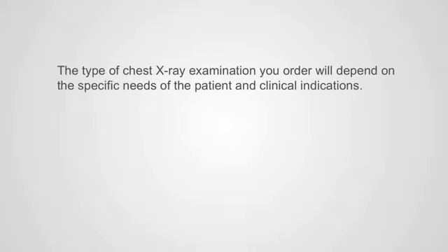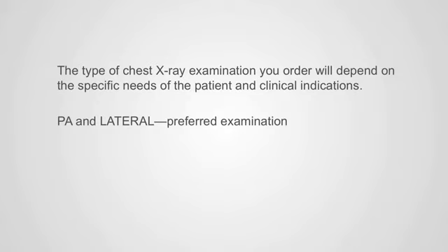So to recap, the type of chest X-ray examination you order will depend on the specific needs of the patient and the clinical indications. The PA lateral X-ray is the preferred examination and is the examination most often ordered and performed. The AP examination is limited for critically ill patients.